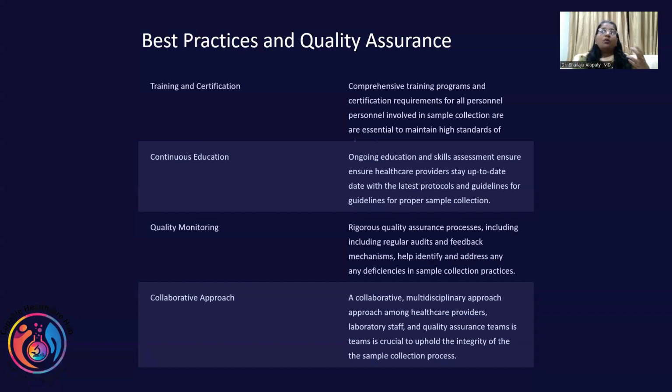So, how do we have the best practices? Training, training, training. Training is not just awareness. We get into it. We dissect the whole thing. At every step, we tell people what they have to do, how they have to do it. Like starting from the MRD, give a slip. Why patient age should be captured properly. Tell them the reason why you can't make a mistake over there.